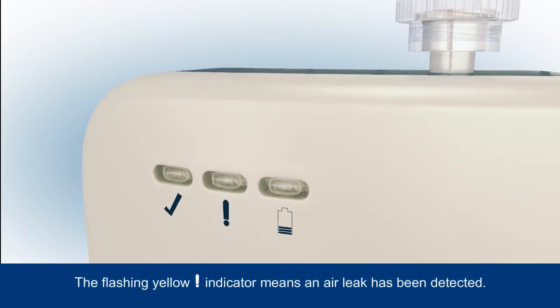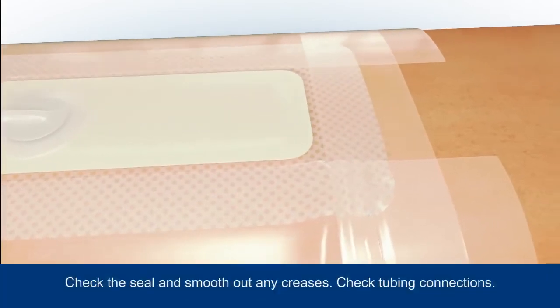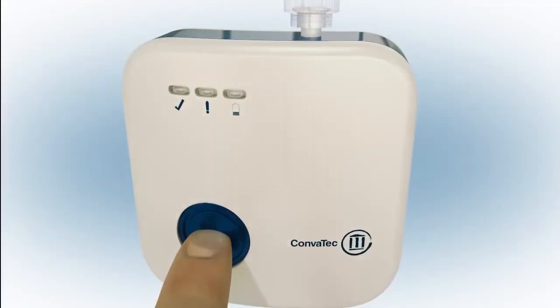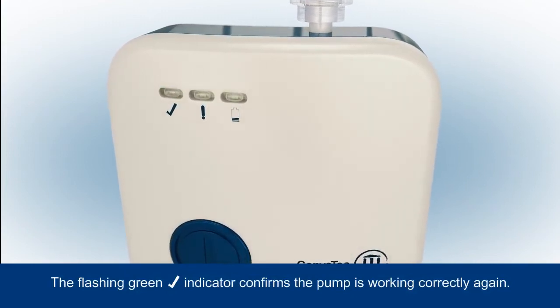If an air leak is detected, this will be indicated by the flashing yellow warning indicator. Ensure you check the dressing seal and smooth out any creases, and check the tubing connections are secure. Press the blue button for 3 seconds to resume therapy. The green tick indicator will then begin to flash as therapy is successfully restarted.